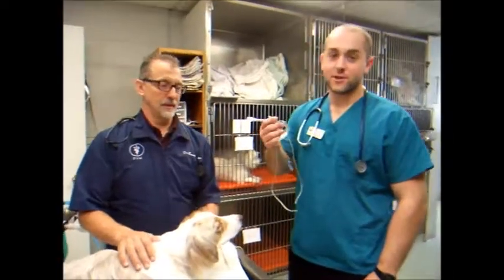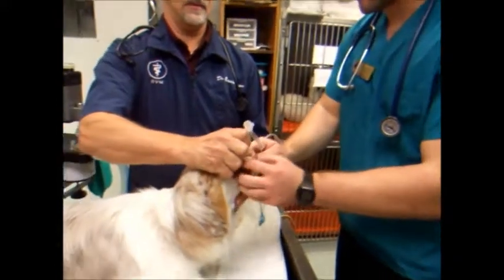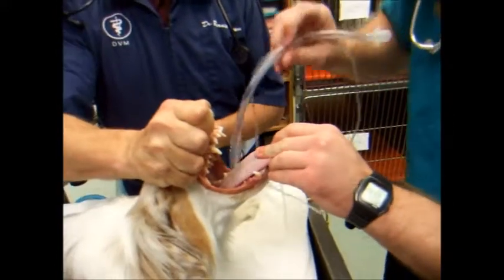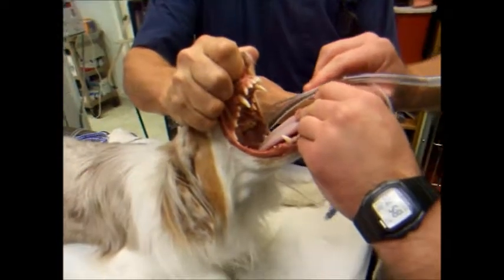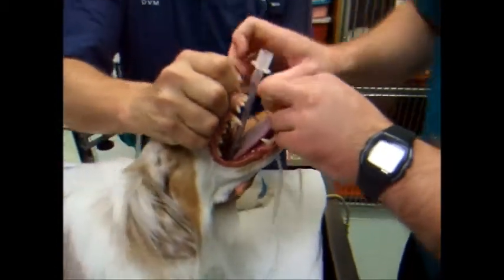I'm going to place an endotracheal tube on our sedated patient here. So Dr. Williams is going to grab her mouth, grab her tongue, and we're going to move the epiglottis out of the way here. We're going to shoot right in between the two arytenoids. And in we go. Coughing is usually a good sign that it's in.